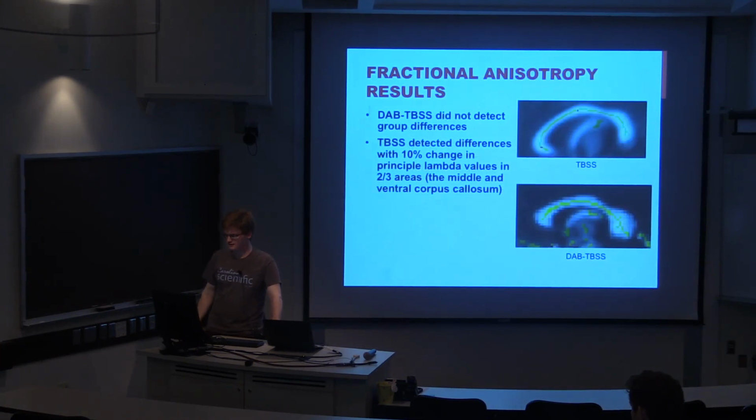Yeah. So basically, we're testing for differences in fractional anisotropy, and TBSS works directly with the one-dimensional FA values for the entire time. So there is a greater likelihood that it's going to find differences in magnitude between each one. I don't think, however, that you're really guaranteed that those differences will be correct.